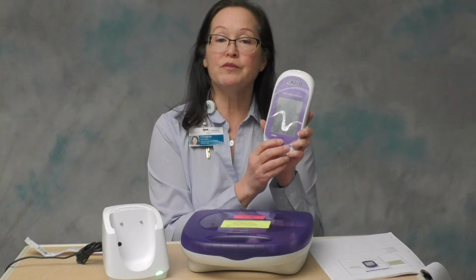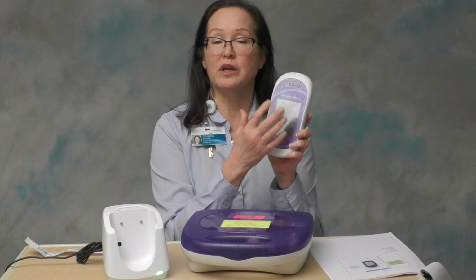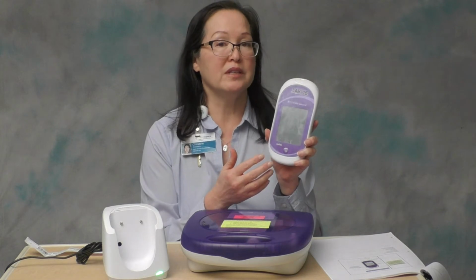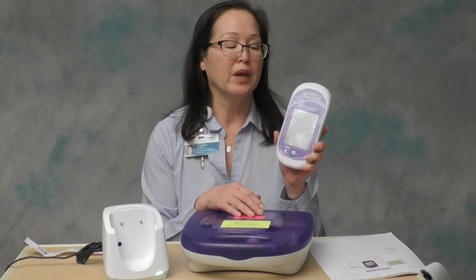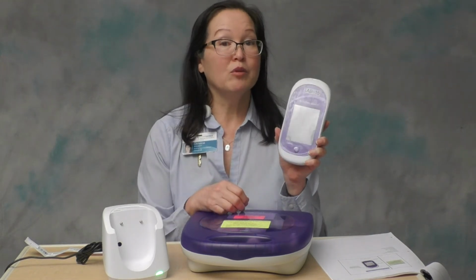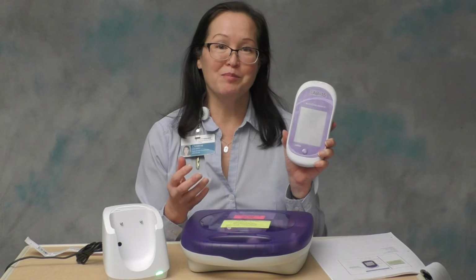You will know if the meter has reset itself because when it comes back on, it will prompt you to enter the date and time, because that information gets wiped out when you reset the meter. You will want to reset the meter if it's not doing what you expect it to do at any point.